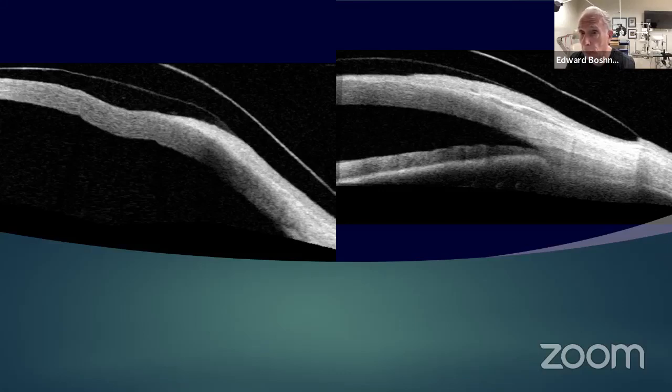OCT, I mean, I can't function without OCT to look at the relationship between the lens and the cornea, between the back of the lens and the cornea. It's so precise. Back before I had OCT, I was putting fluorescein on the lens and looking with a narrow slit lamp beam to figure out how much clearance I had, which to me was prehistoric. I mean, it's so old.